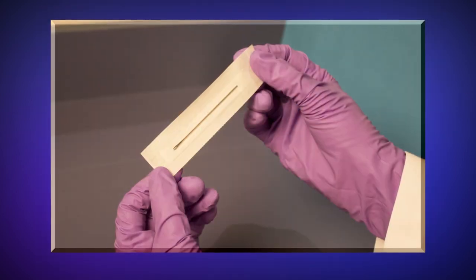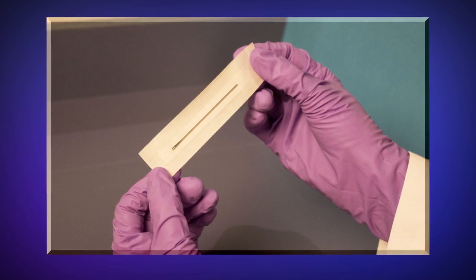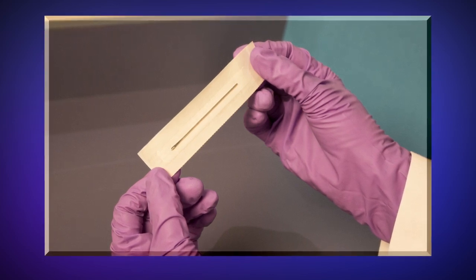Prior to vaccination, carefully inspect the individually packaged bifurcated needle to ensure that the package and seal are intact. Do not use a bifurcated needle if the package appears compromised, damaged, or tampered with, and dispose of it in a biohazard sharps container.